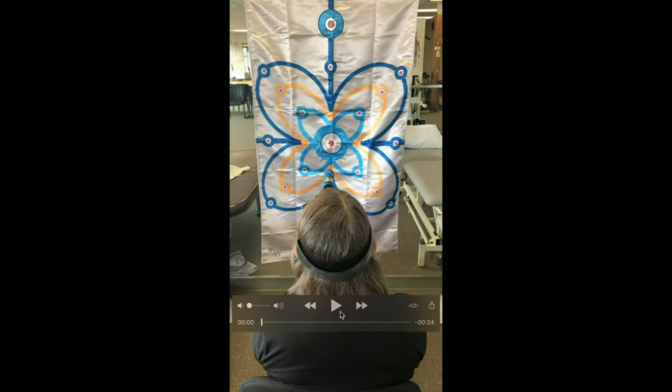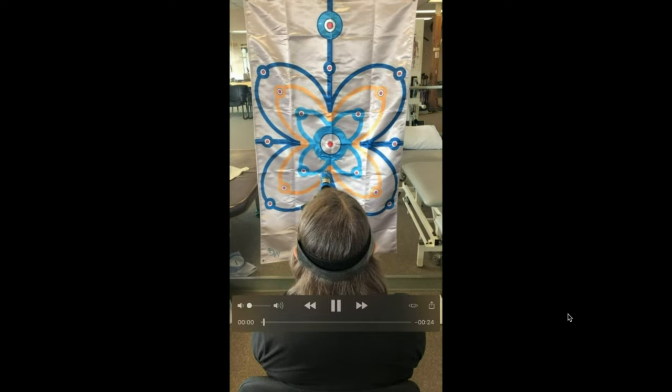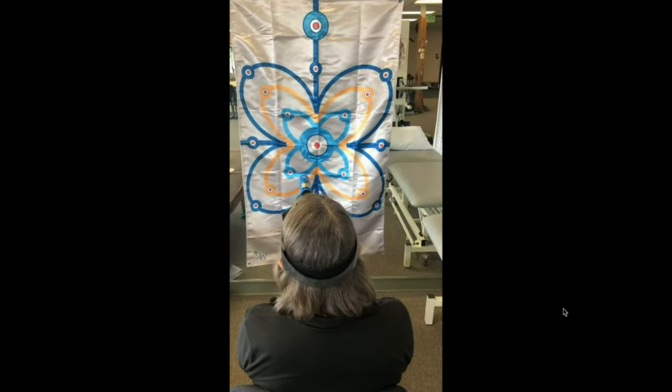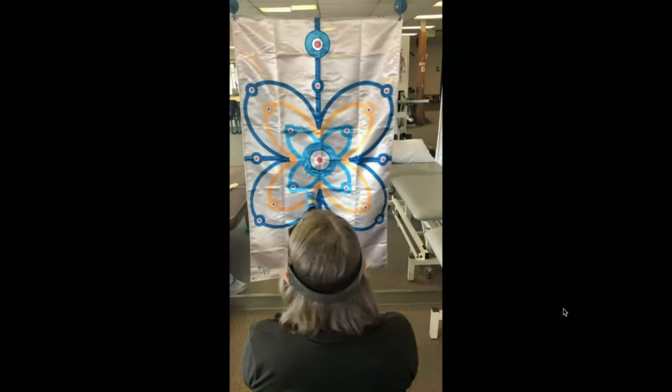Let me get rid of the audio here. So she's looking at the center red target and then just moving back and forth. So let's just watch this one time through.